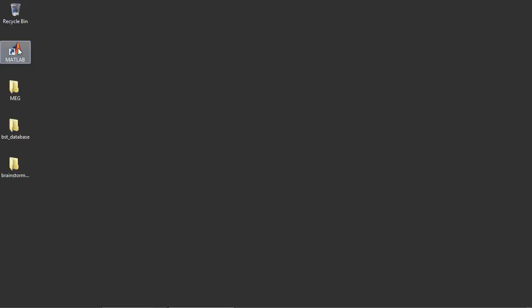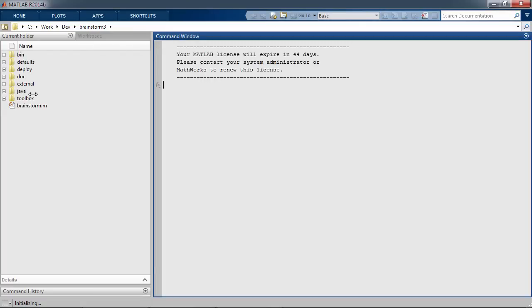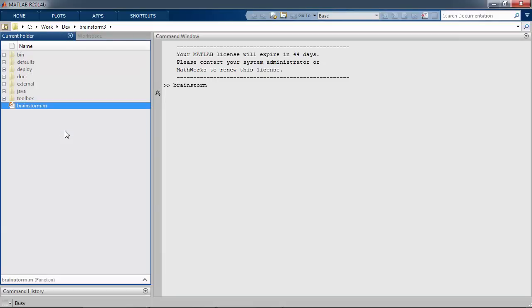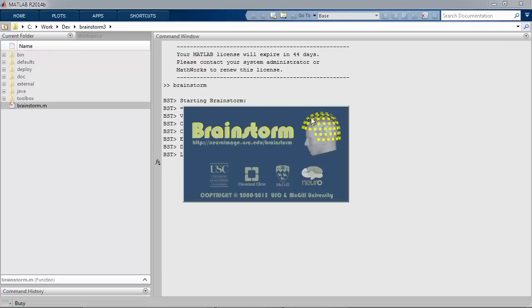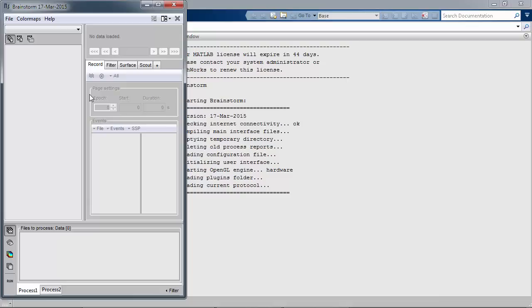We're going to start MATLAB here to get started with the demonstration. We have on our website the compiled version of the software, in case users are interested in using it without a MATLAB license. So we're going to run Brainstorm here. This is essentially the last command line interaction you're going to do, because the rest of the story is focused on using the graphical user interface. Here is the main Brainstorm window, where on the left you have the panel where the database explorer and data tree will be populated.